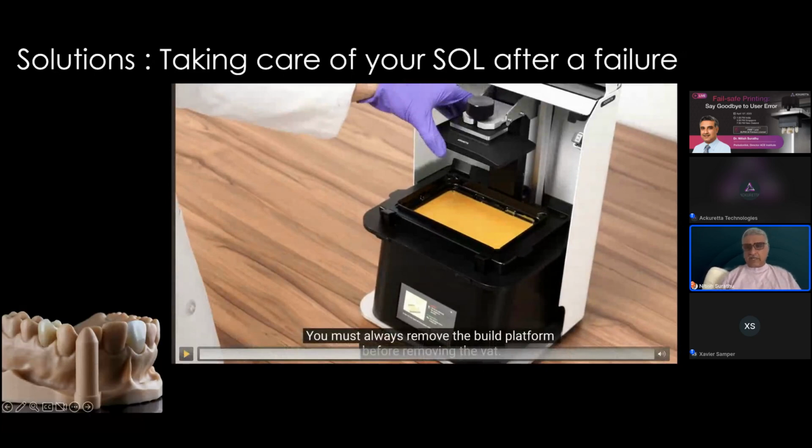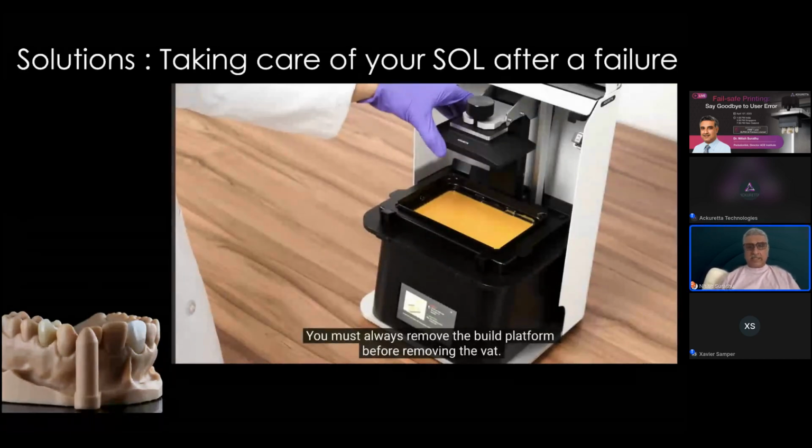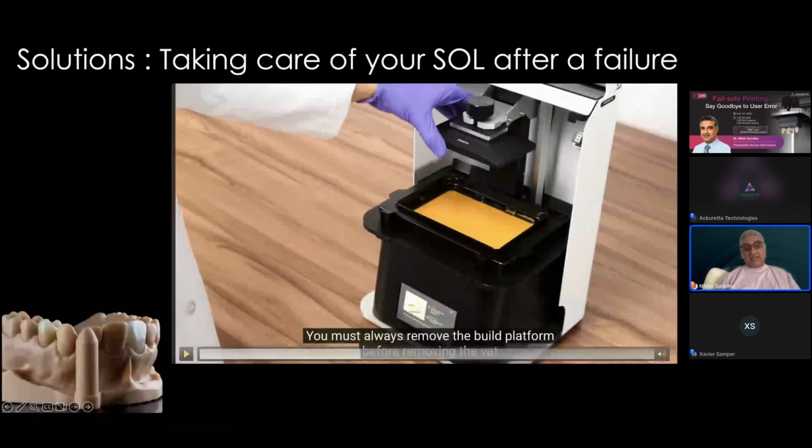The clean vat function has a certain time duration to it that, as I said, is programmed according to the resin. If you turn on the clean vat function, it causes the LEDs of the printer to come on for the period of time that the clean vat function mode is on. And so what that does is it cures a rectangular layer of resin within the vat.